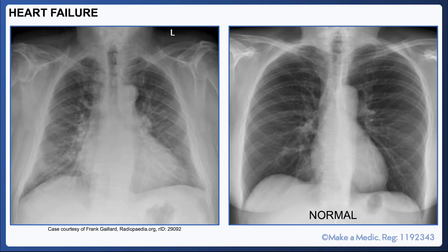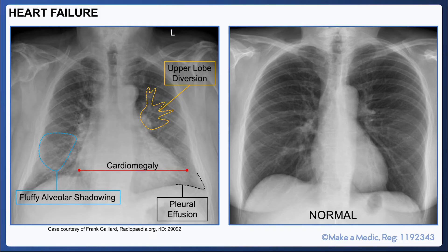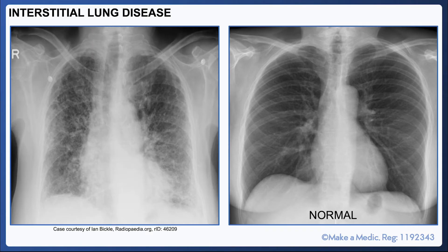Patients with decompensated heart failure are very common on the medical take list, so you'll inevitably come across chest X-rays that look like this. First of all, you will note widespread fluffy alveolar shadowing, which occurs due to the presence of fluid in the interstitium. You're also likely to notice that the cardiothoracic ratio is increased. Upper lobe diversion refers to the prominent appearance of upper lobe blood vessels as the pulmonary vasculature attempts to adjust to the presence of fluid, primarily at the bases, by diverting blood towards better ventilated regions of the lungs. Some fluid may also leak into the pleural space, resulting in a pleural effusion.